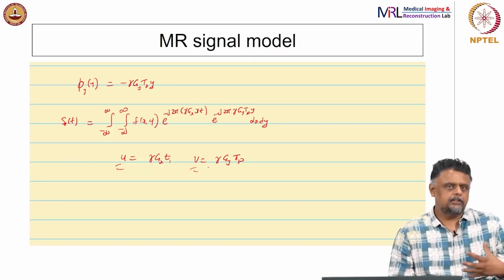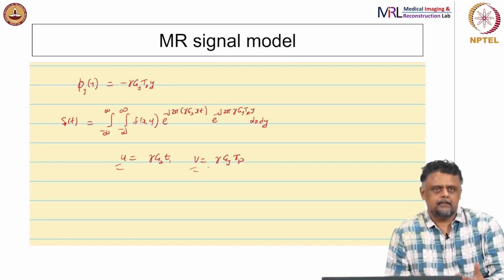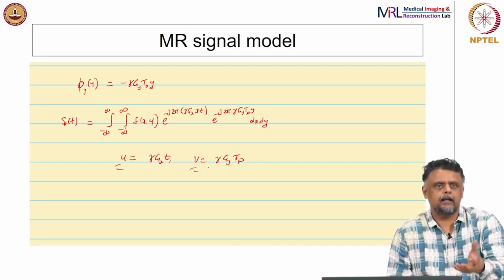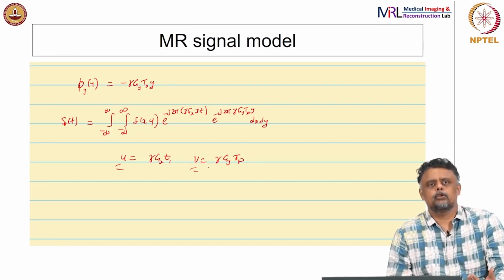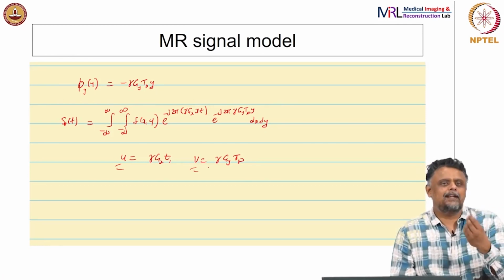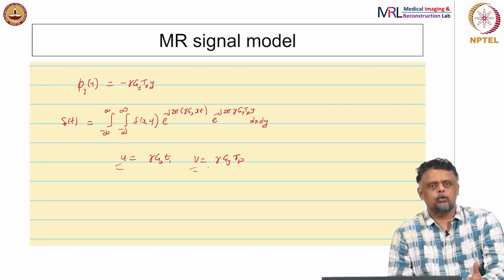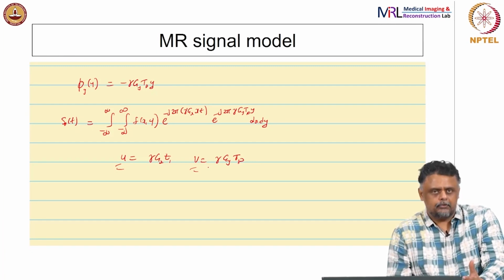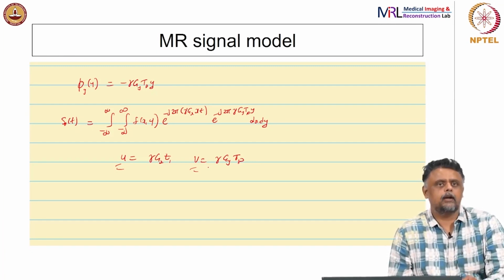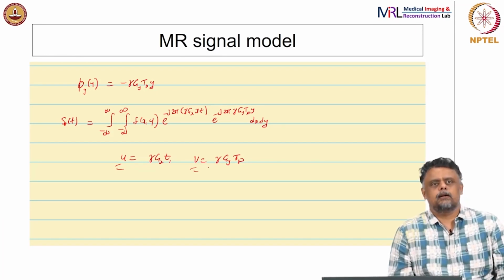as a function of position has all the relaxation time terms as well as the magnetization density in it, and it is just a complicated function that you measure. And so, your images that you measure in MR are functions of the so called spin density, which is basically the magnetization, as well as the T1 and T2 relaxation times. These are basically the physical quantities that you are actually trying to measure by using MR images.